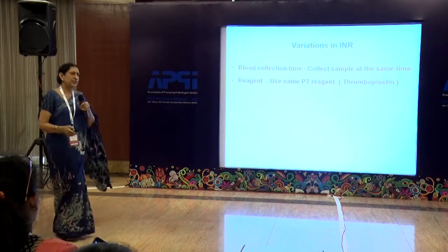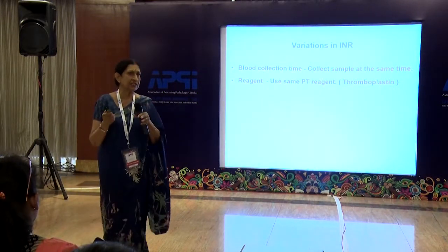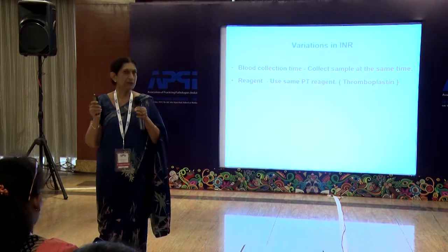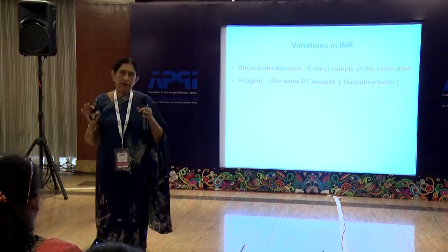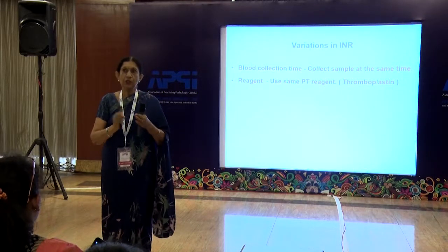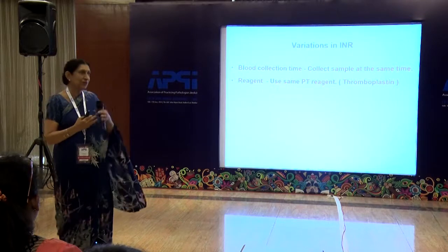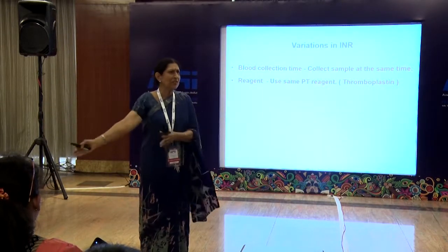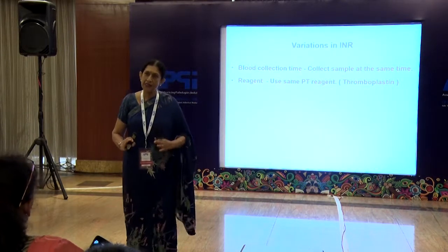Use the same PT reagents. I tell all my students, I tell all my pathologists, do not change your reagents often. If you are catering to people who are on anticoagulation, choose a good reagent and stick to it. Do not change your reagent. [Hindi: Today I changed this, today another came and said our reagent is very good, ISI is even better, let's prepare another.] No, your patients are going to have problem. Don't ever do that. Standardize your method.